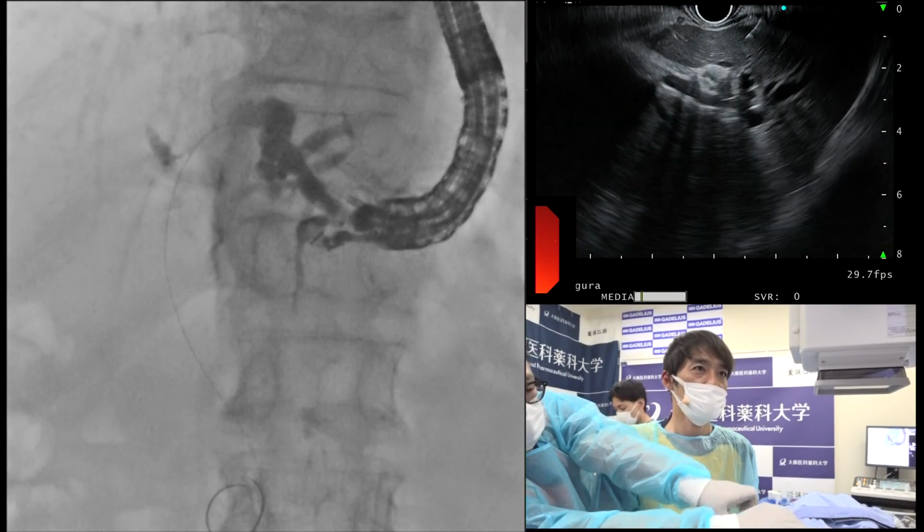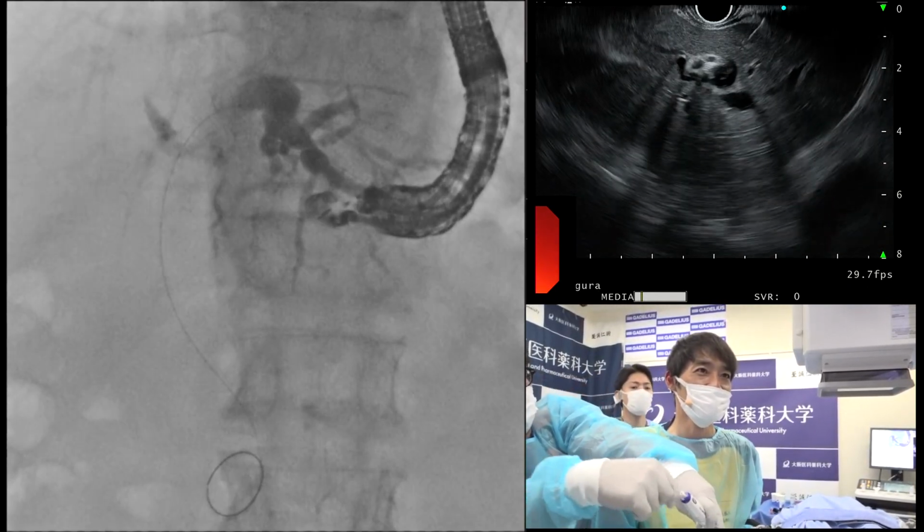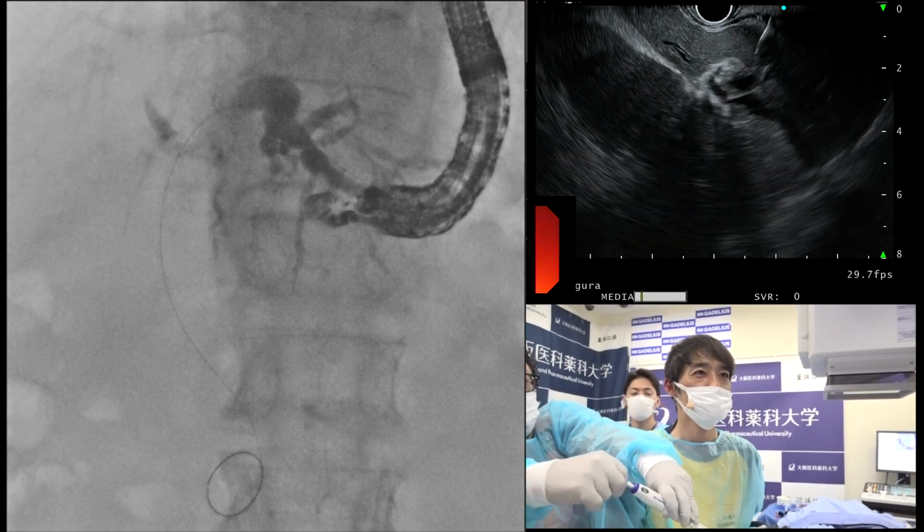Which ERCP catheter are you going to use? MTW.